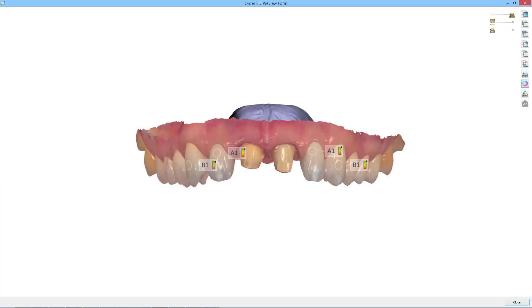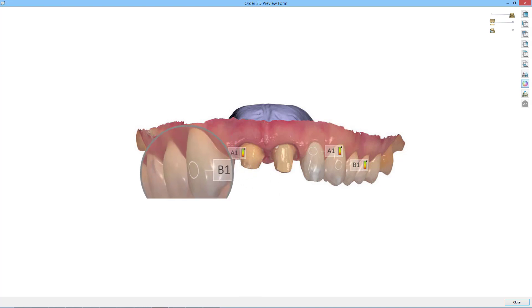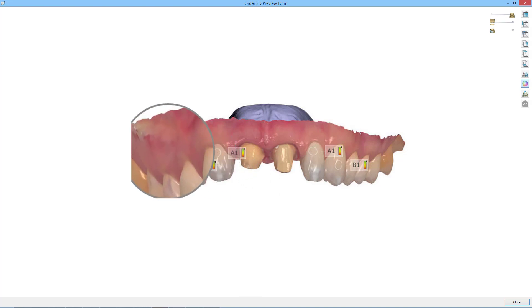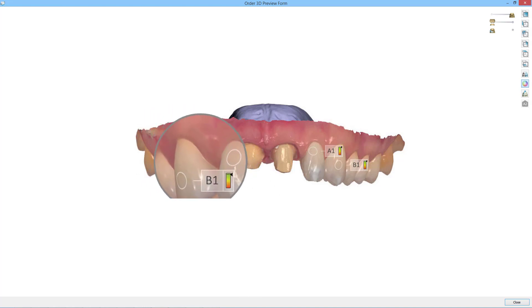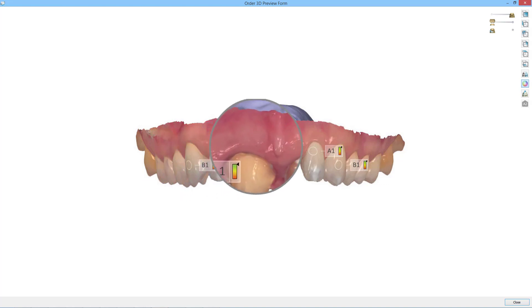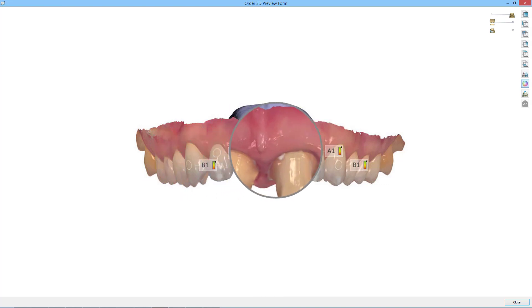Trios Inbox gives you the ability to read the Trios 3OX and Trios 3OXZ scan files, which are exclusive for 3Shape software. This is the only way you will have access to the full range of Trios features, like scanner-acquired texture or shade measurements.